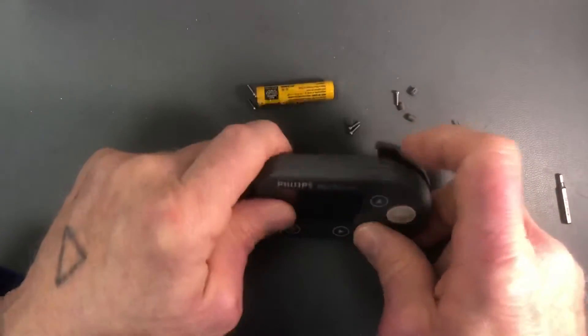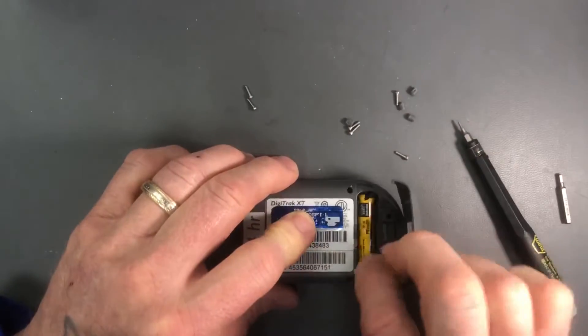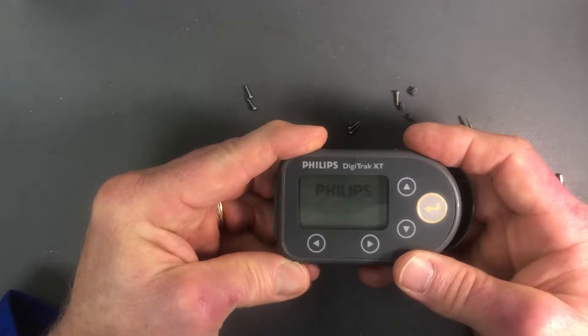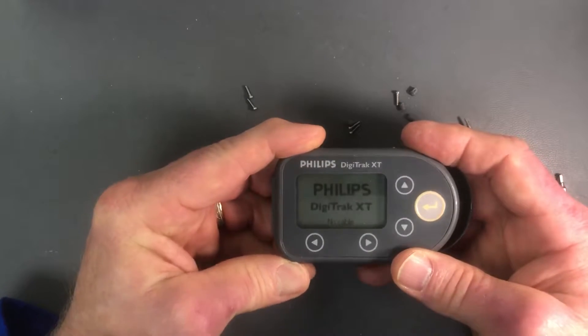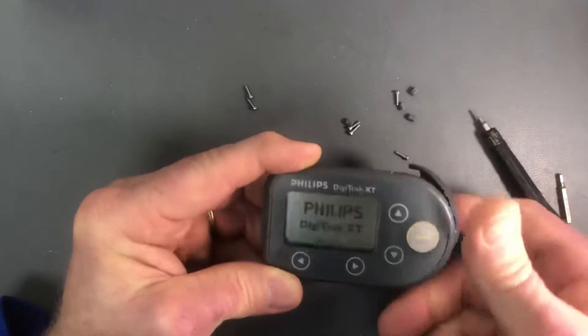To verify that, we'll put this cover back on temporarily, put the battery in, turn it over, and look at the display. It comes up with a normal Philips Digitrack XT display indicating that the problem has been remediated.